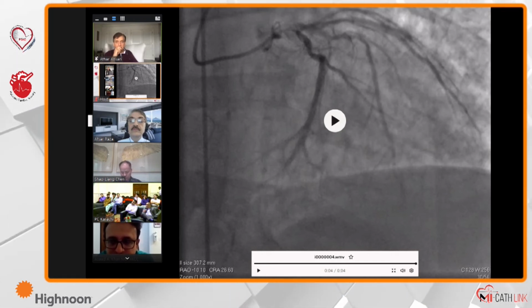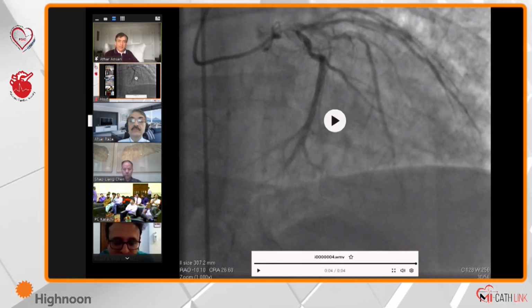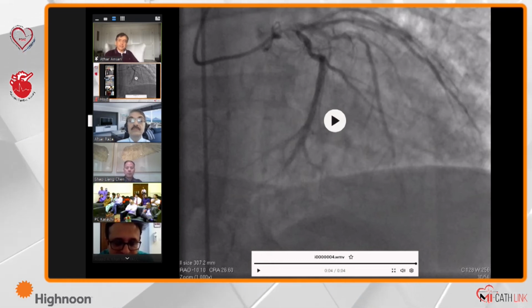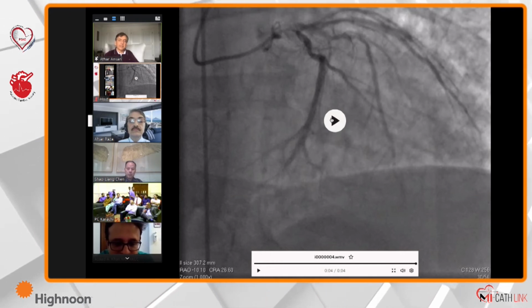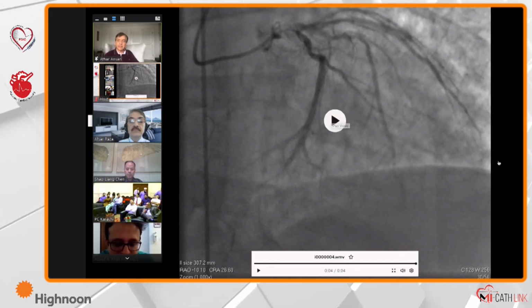Yes, I think the way this left main looks, it's serving around 70-80% of the myocardium through this system. So I would probably not wait. I probably expect the right to be a small vessel.